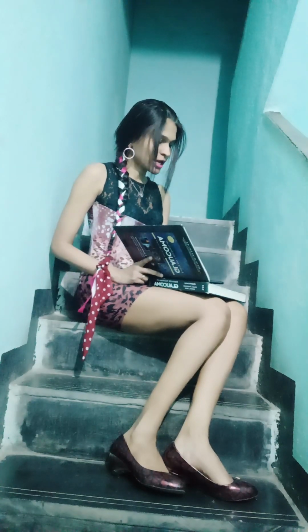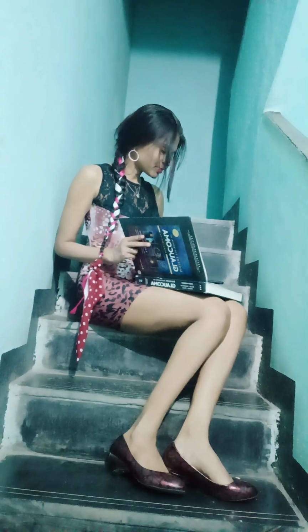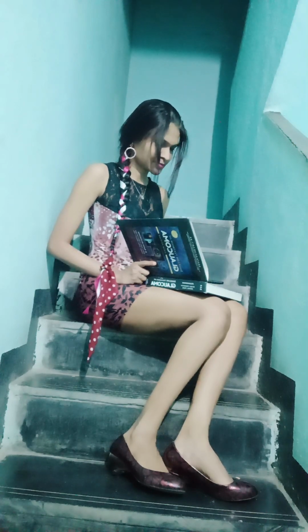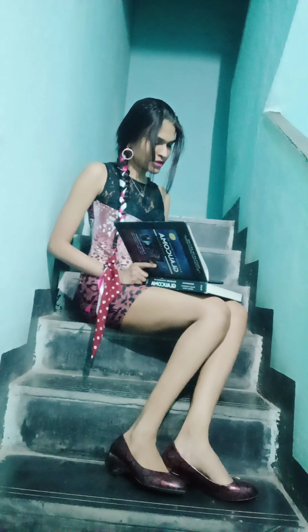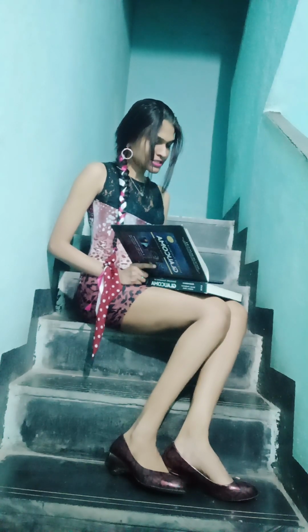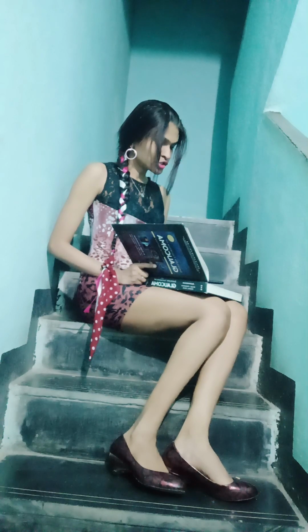So in this video, I'm going to read Shields' Textbook of Glaucoma, which is the 6th edition. It's chapter 3, page number 41. Gonioscopy and other techniques for assessing the anterior segment. Assessment of the anatomy of the anterior chamber angle by gonioscopy is an essential part of the glaucoma evaluation. The drainage angle as well as other structures in the anterior segment, namely iris insertion and ciliary body anatomy, can also be assessed by using ultrasonographic and laser imaging techniques and cycloscopy.